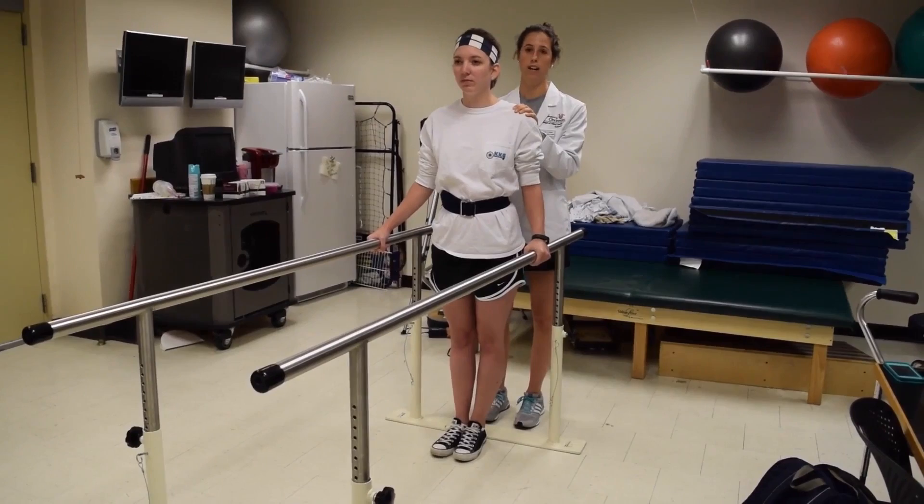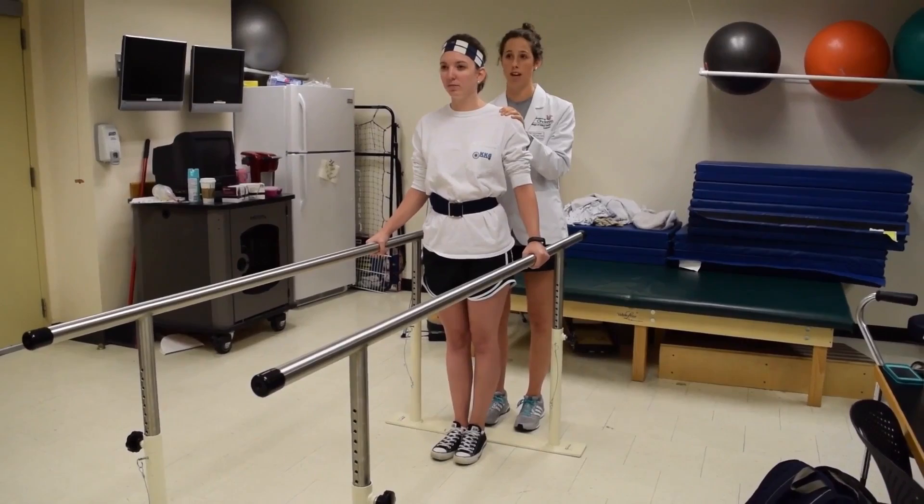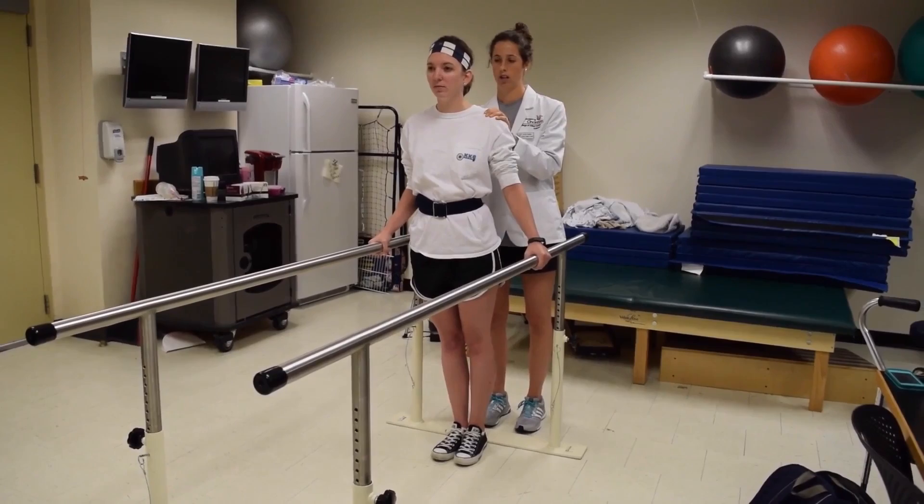We come back to center. Now we're going to do that on the right side, the same thing. And now we're going to go forward, and then back toward me.